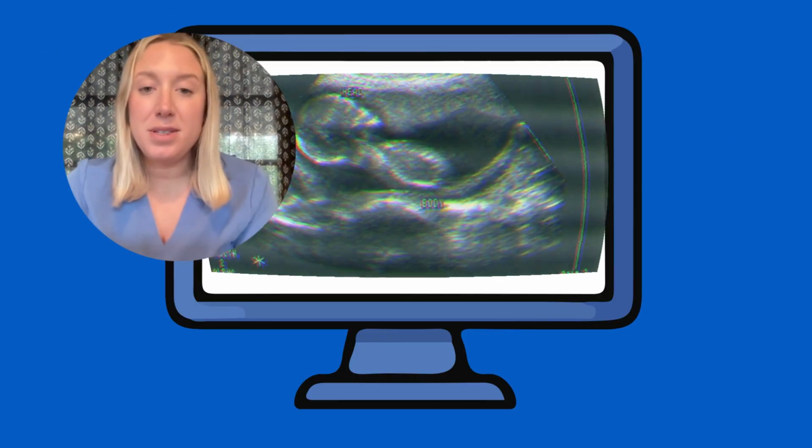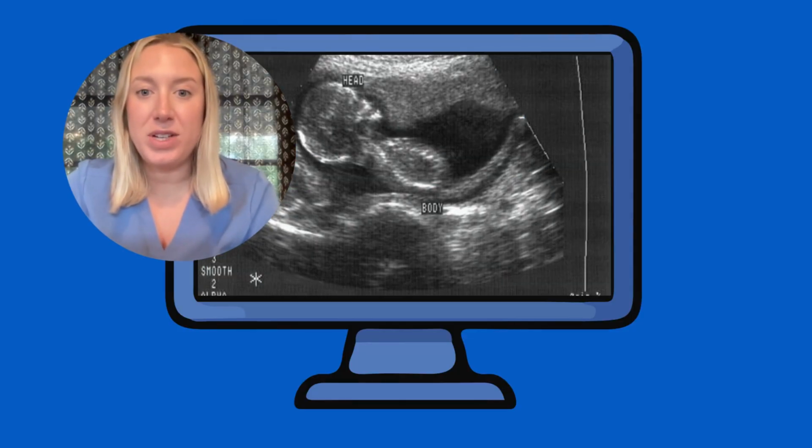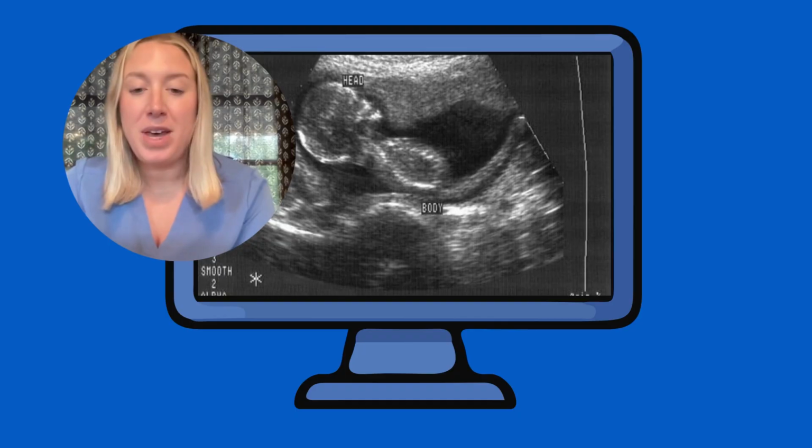Finally, it makes it to the display where all of the processed data is visible in an image on the screen. This allows the sonographer to interpret the anatomy and the motion in real time.